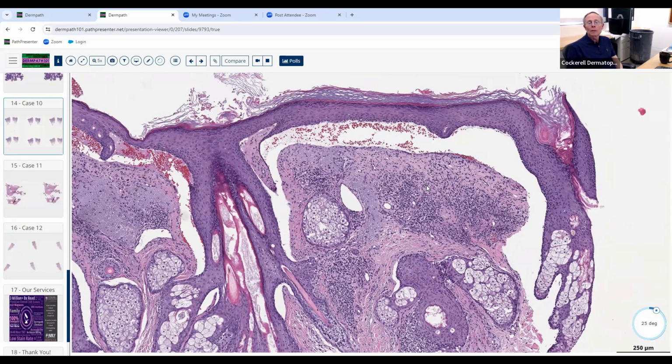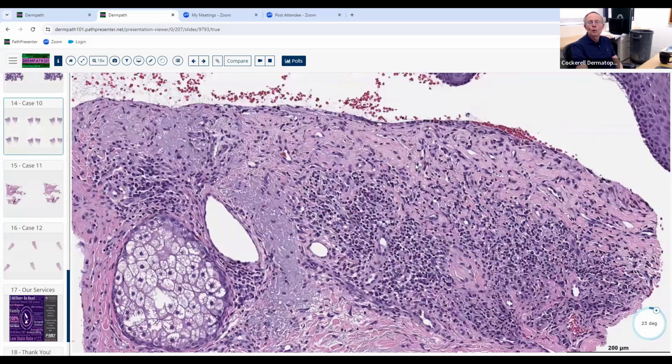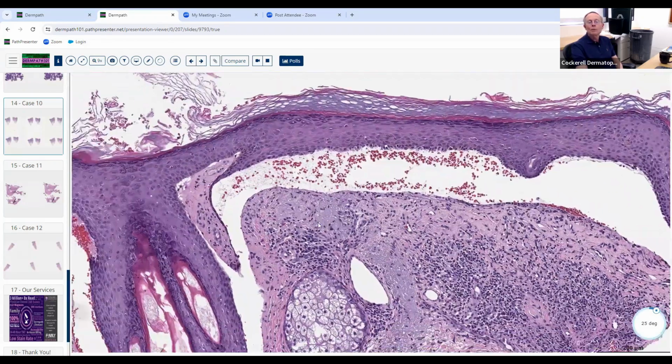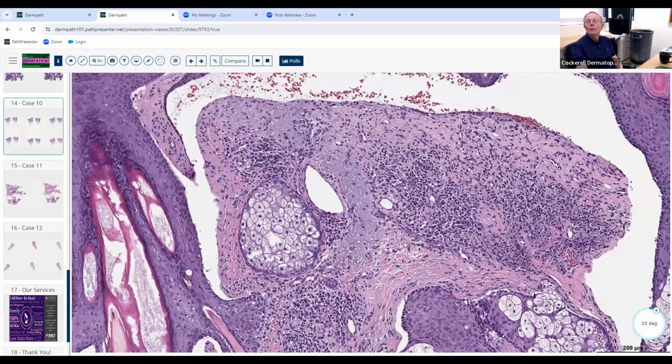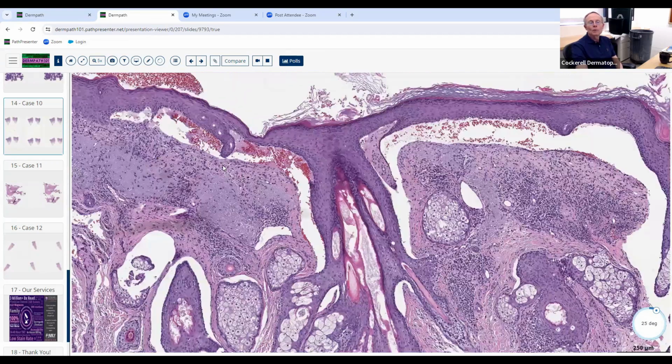And there's 2 forms of cicatricial pemphigoid. There's the mucosal form, and then there's the non-mucosal form, the so-called Brunsting-Perry form of cicatricial pemphigoid, that occurs usually in older individuals, the scalp, the face, common location for that. And this is a fantastic, beautiful example of that disease. You just are never going to see it any better than this. So if they show you this on the board examination, it's going to be something like this. A gorgeous, classic example of cicatricial pemphigoid.